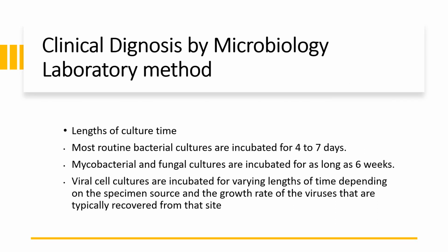The clinical diagnosis also is affected by the length of the culture time. Most routine bacterial cultures are incubated for 4 to 7 days. Mycobacterial and fungal cultures are incubated as long as 6 weeks. Viral cultures are incubated for varying times depending on the specimen source and the growth rate of the viruses that are typically recovered from that site.